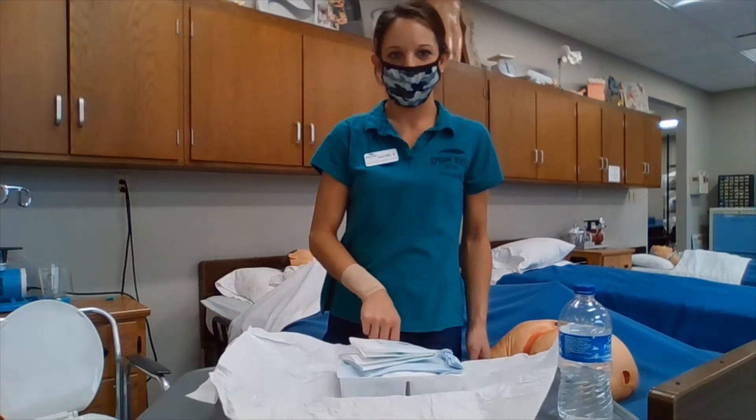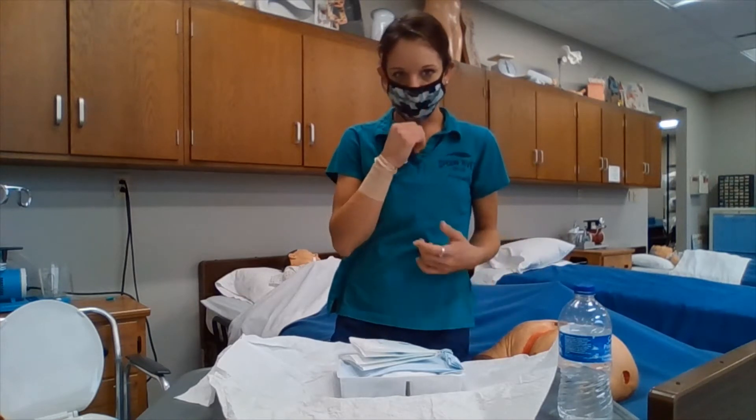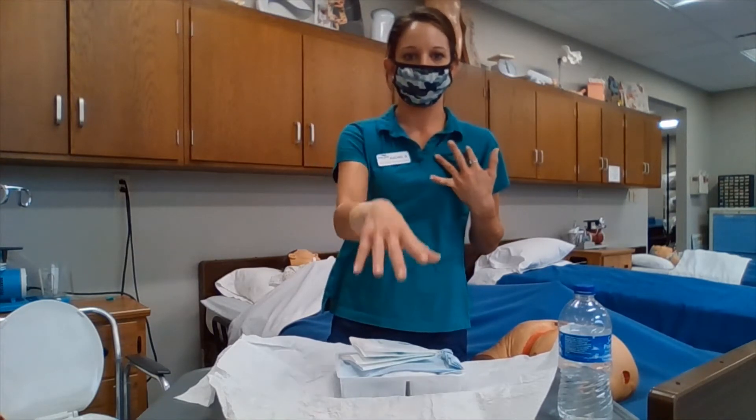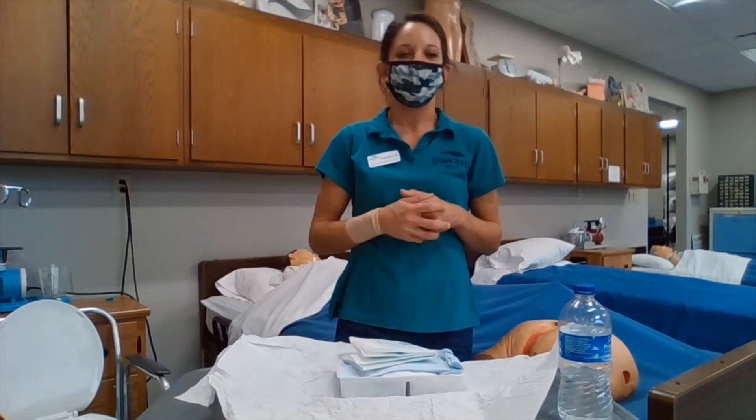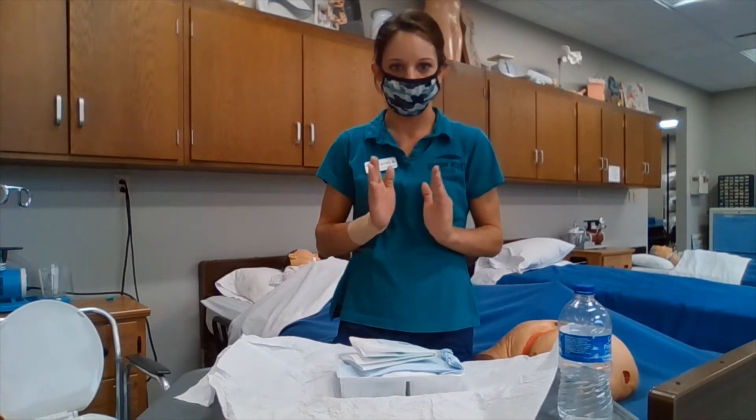We are making sure that we are not touching the inside of our sterile field. Some of the rules that apply: we do not turn our back on our sterile field, we do not reach across it, and sterile always touches sterile.